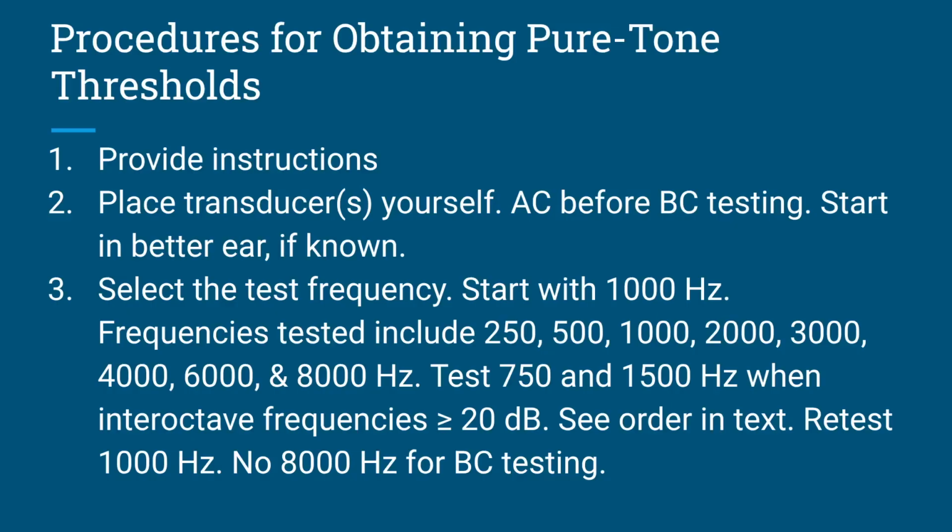But you'll struggle to impact. It will have negligible impact on hearing aid settings. 125 hertz is not really relevant to hearing aid settings, and that's because hearing aid ear molds and domes are vented, so you're not typically amplifying at 125 hertz. So it's not going to be a big deal.